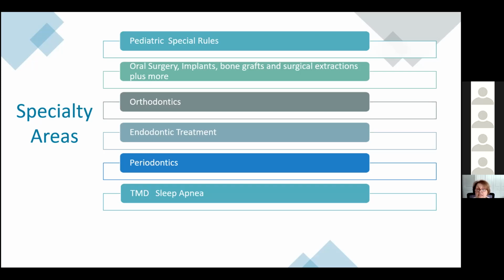And by doing a CBCT scan, they could see if there are other canals, and to do that endodontic treatment which includes all the canals and whether or not the disease has spread more into the jaw. So they are really looking at it as standard of care.